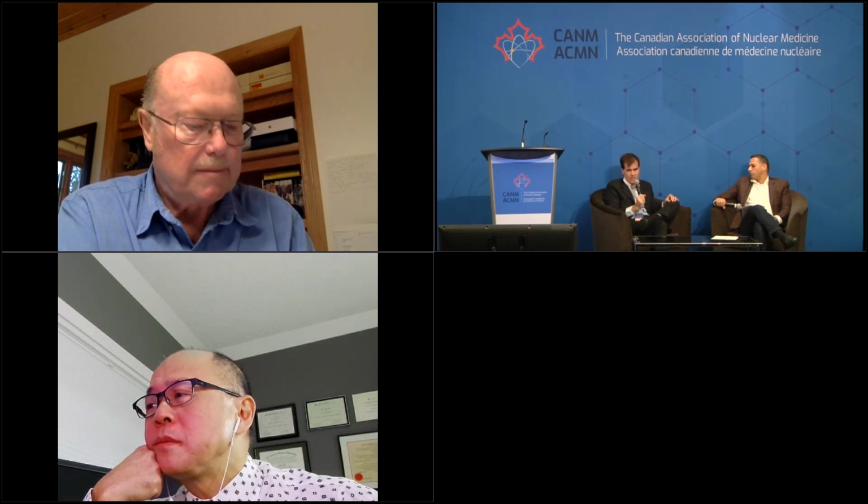Mm-hmm. I just want to say, we have the same observation with gallium, that the spatial resolution is very limited, and we always do a bone scan in conjunction with the gallium. If the gallium shows intense activity without any bone tracer, then there's no bone involvement. If the bone scan is abnormal, then it is positive for osteomyelitis.